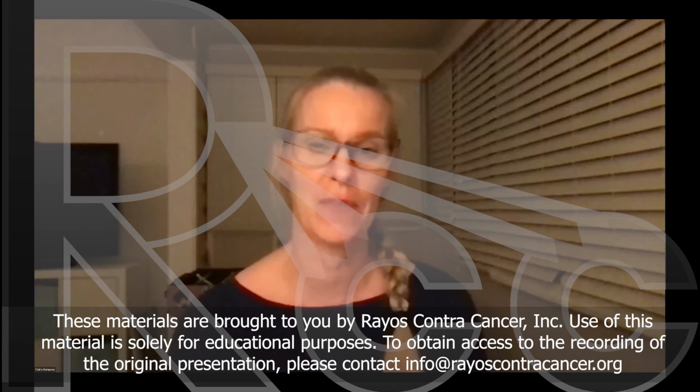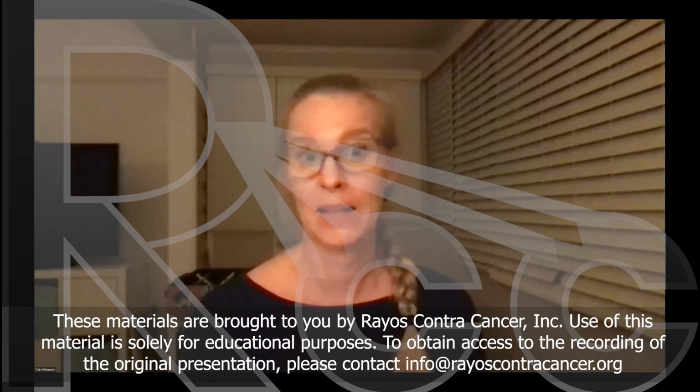Yeah, look, I think particularly if you're looking at kV and ConeBeam CT doses, even if you do a dose calculation or take a measurement, the dose that you're going to be getting is like a whole body equivalent dose. So you can't really add that to a prescription because you're not comparing the same thing. So your imaging dose is calculated in a different way than your radiation therapy treatment dose. So it's a little bit more difficult. You can't just add the two together because they're actually calculated off different things.